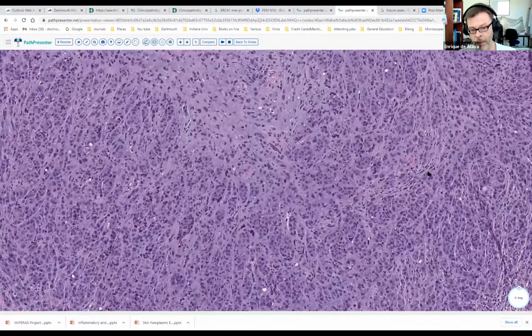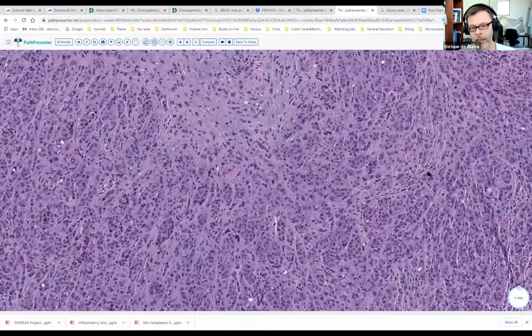But my main idea would be, okay, this could be some myoepithelial lesion, maybe a myoepithelial carcinoma, or maybe I would like to figure out whether this is an extraskeletal myxoid chondrosarcoma. So I will basically go to some immunos to rule out muscle and epithelial markers, and maybe some NR4A3 rearrangements to rule out extraskeletal myxoid chondrosarcoma.